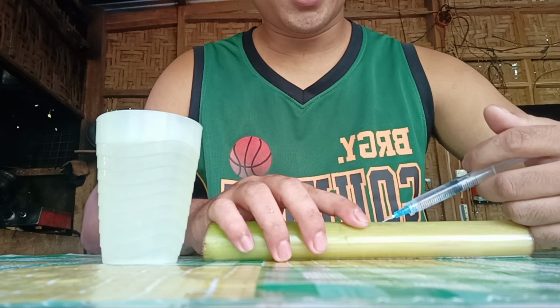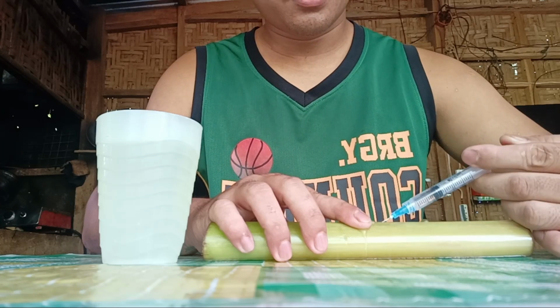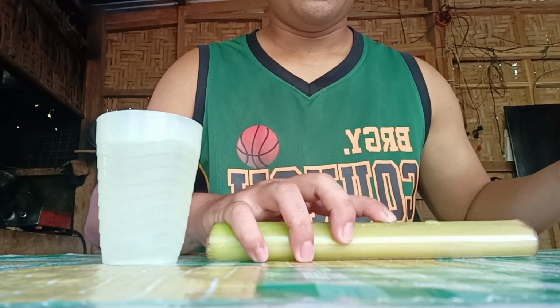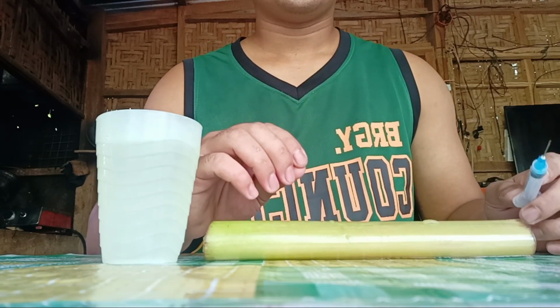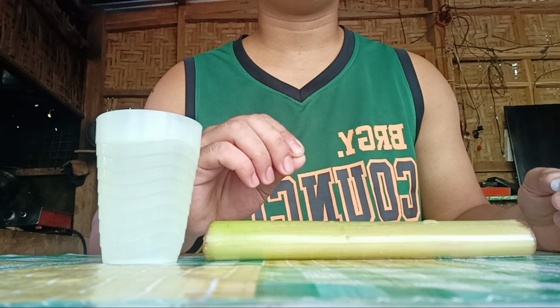Then inject the medicine. Massage after injecting. And that is the intravenous injection.